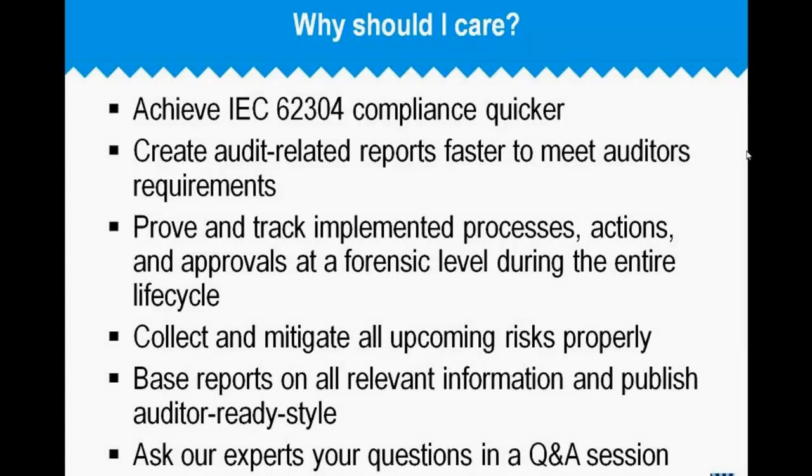The important thing is not necessarily the form and the details of what specific things you're doing, but you have to start from first principles in terms of demonstrating your understanding of your regulatory obligations, having a thorough understanding of how you actually do software development in your organization, and then being able to explain clearly why those particular processes and artifacts that you're generating are compliant with a particular standard, in this case 62304.